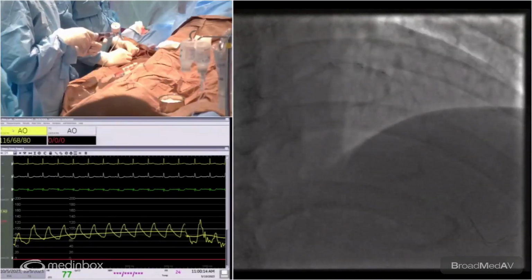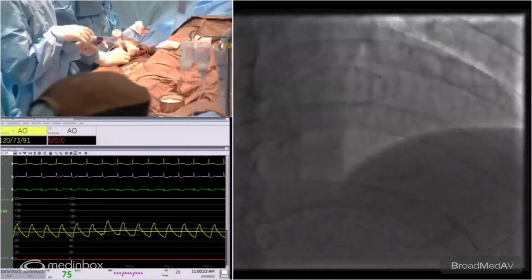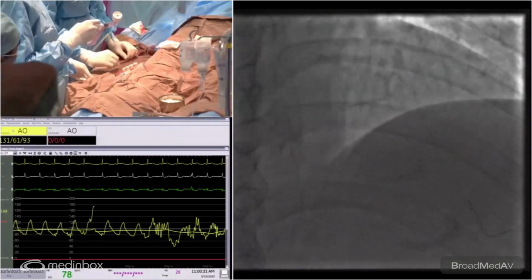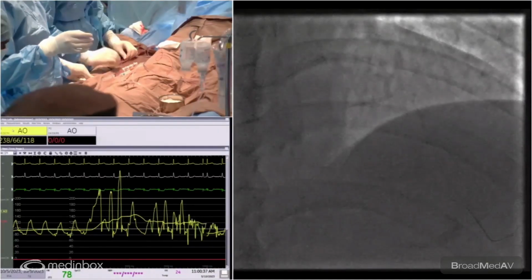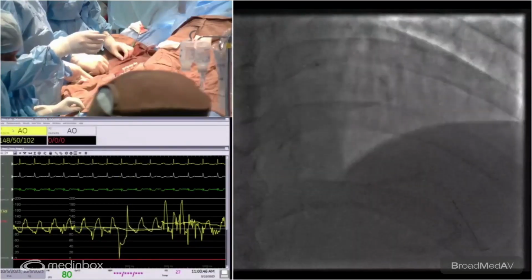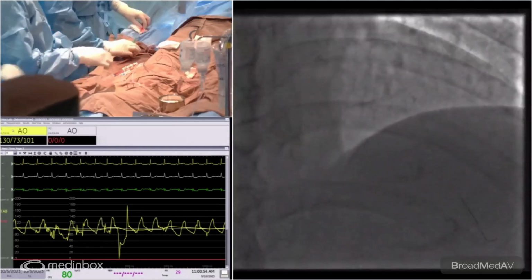4, 6, 8. So we prepared the bed reasonably, get the balloon off, and then we get the 3/26 stent in. Okay. So prep the 3/26 stent, please, sister. Should we use the same platform? Switches, please. Yeah, sure. 8. Let's take a shot and then we'll take a 3.0 stent. The previous stent was a Xience in the LAD.